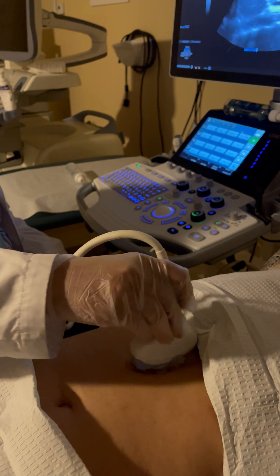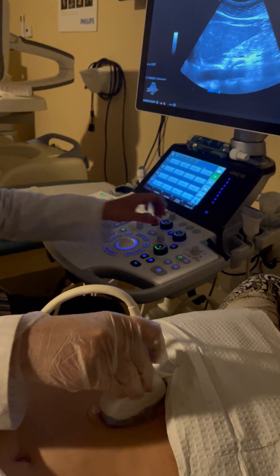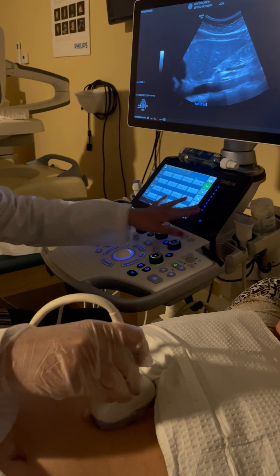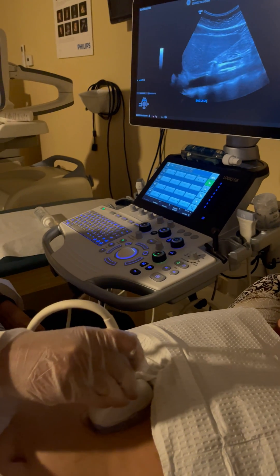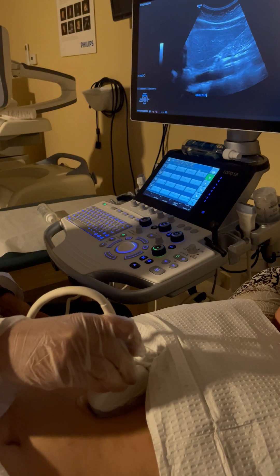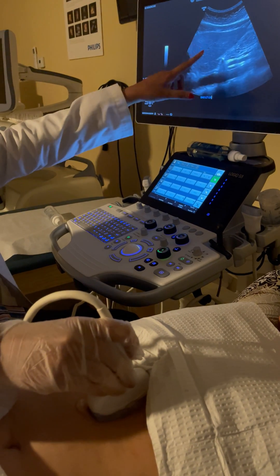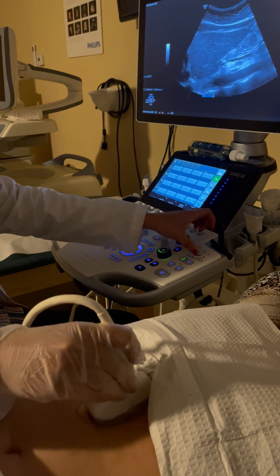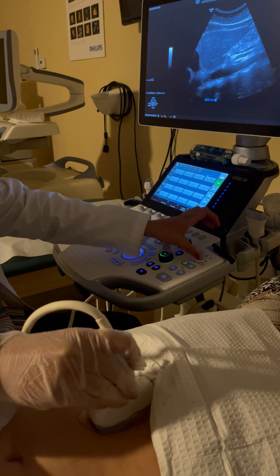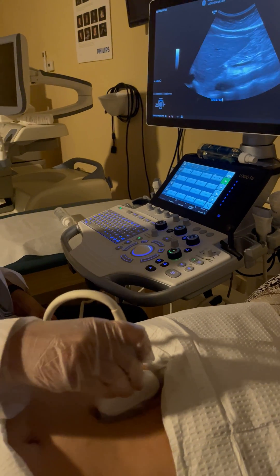Starting with the first few images of the sagittal liver. The first image is the sag left lobe. Whenever you take images of the liver, make sure the TGC is optimized to show the liver echogenicity as normal — it should not be too dark or too bright. Also make sure the liver is occupying most of the space; optimize the depth so the liver occupies at least 80 to 90 percent of the image.